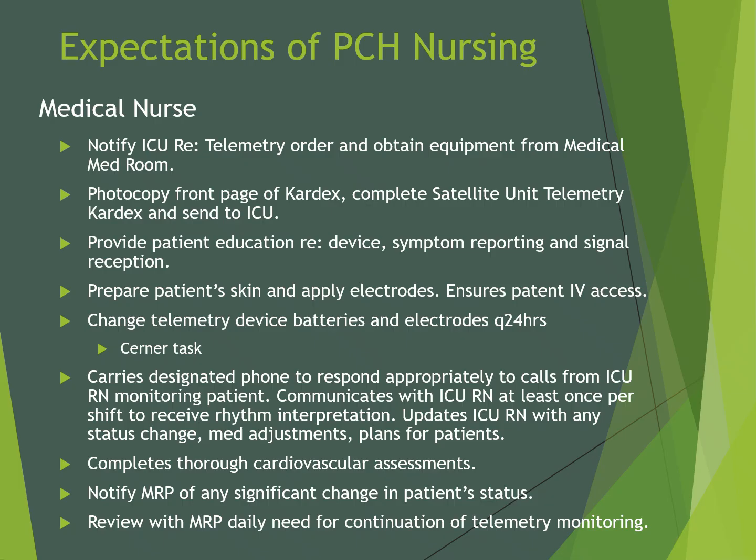We will be responsible for providing patient education regarding the device, symptom reporting, and signal reception. And we will prepare the patient's skin and apply the electrodes, ensuring that the patient has patent IV access. Every 24 hours, there will be a Cerner task fire to change the telemetry device batteries and electrodes, and the medical nurse will carry a designated phone to respond appropriately to calls from the ICU RN monitoring the patient.